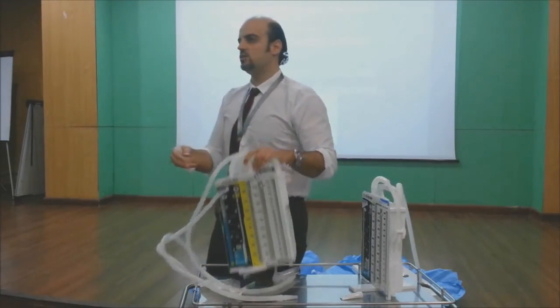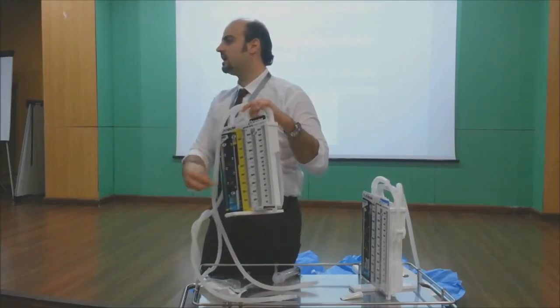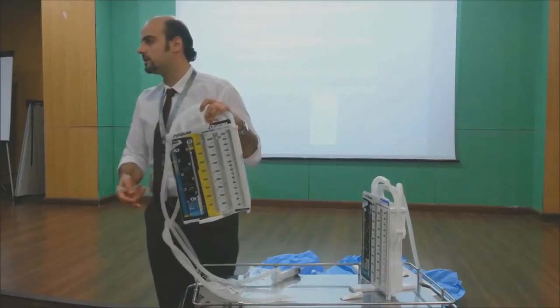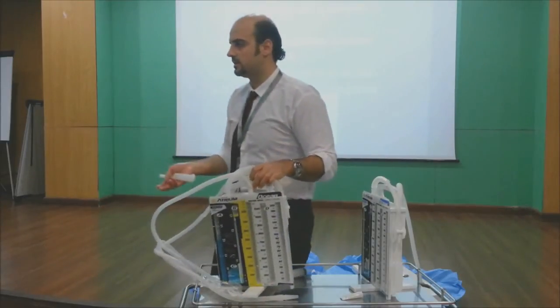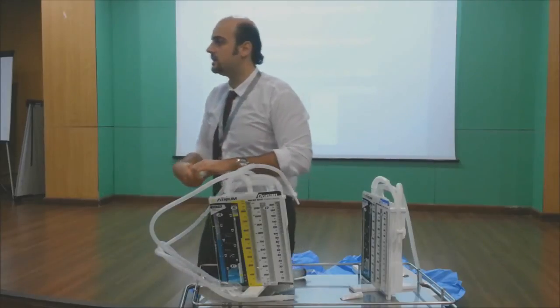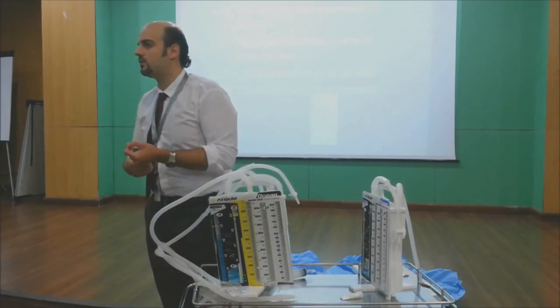But if this tube is normal, and I put it only for pleural effusion or hemothorax, I can clamp it even for 6 hours, because there is no air to collect, nothing serious. It will just collect some fluid.